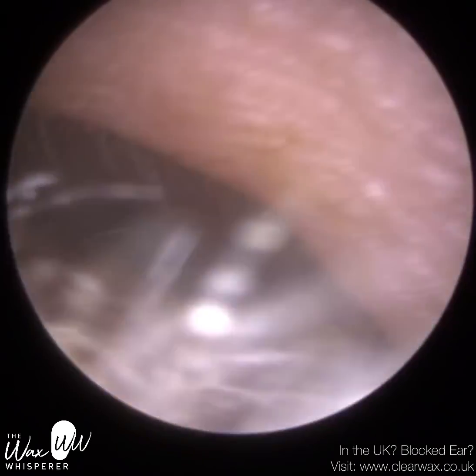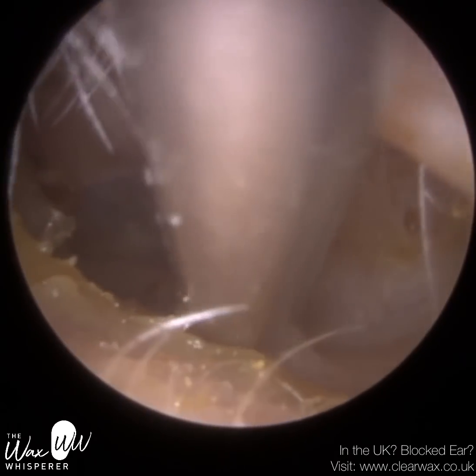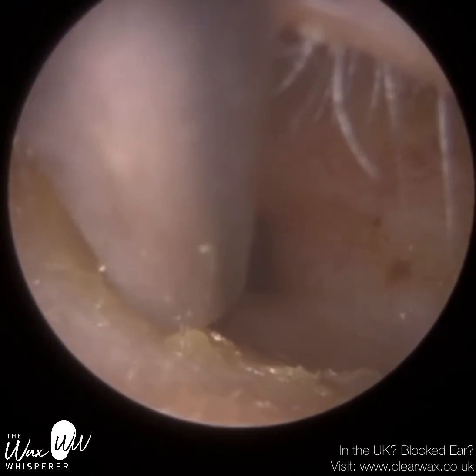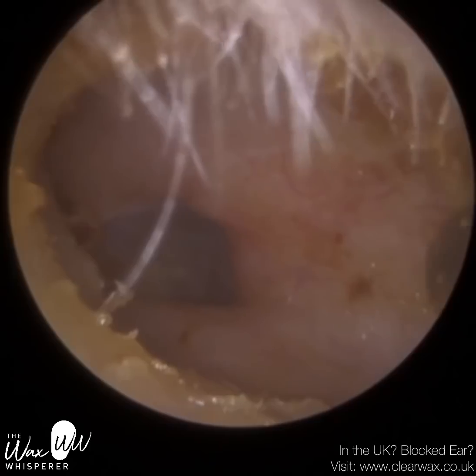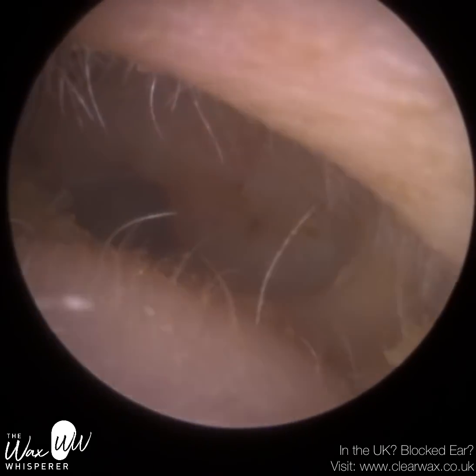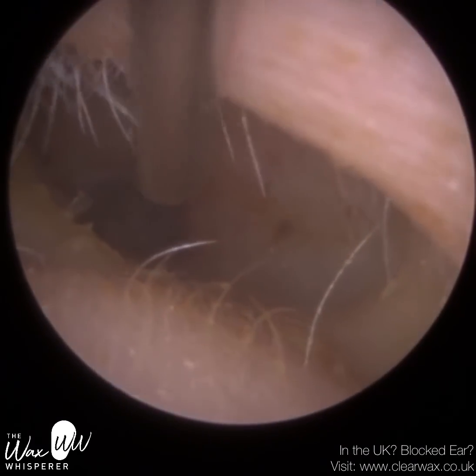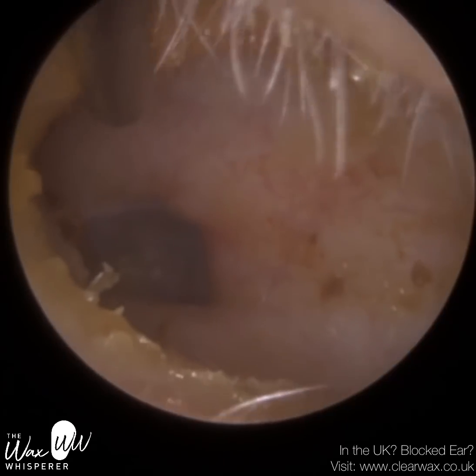You can see I'm just cleaning it all out with a Sonstar suction probe. I am going to attach a fine end, because on those bony spurs there is a bit of wax and dead skin. You have to be really, really gentle because they are very sensitive if you make contact.